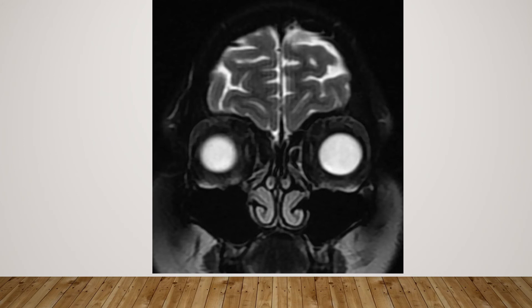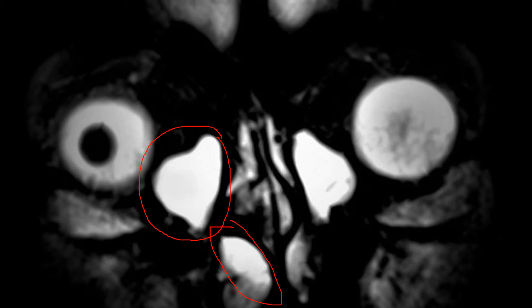To demonstrate the nasolacrimal drainage apparatus on this T2-weighted coronal image: here is the location of the lacrimal sac, which drains into the nasolacrimal duct, which further drains into the inferior meatus near the inferior nasal turbinate. Going back to our case, what we can see on the T2-weighted coronal image is the dilated lacrimal sac and the dilated nasolacrimal duct. These findings are bilaterally symmetrical. The cause of this obstruction is at the level of the valve of Hasner, causing bilaterally symmetrical dilatation of the lacrimal drainage apparatus.